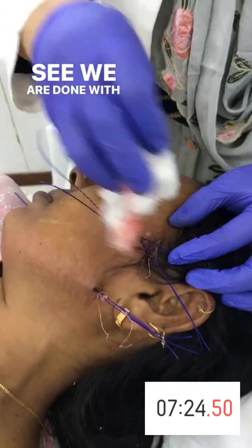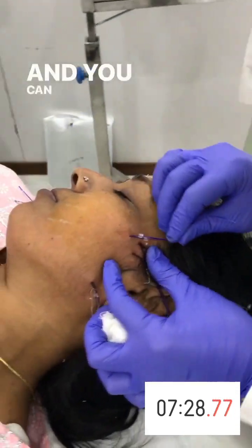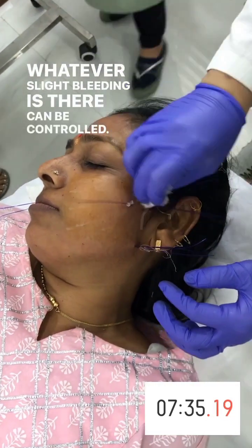We're done. I've put 10 threads on either side of the patient, and you can see the patient is absolutely comfortable. Whatever slight bleeding is there can be controlled.